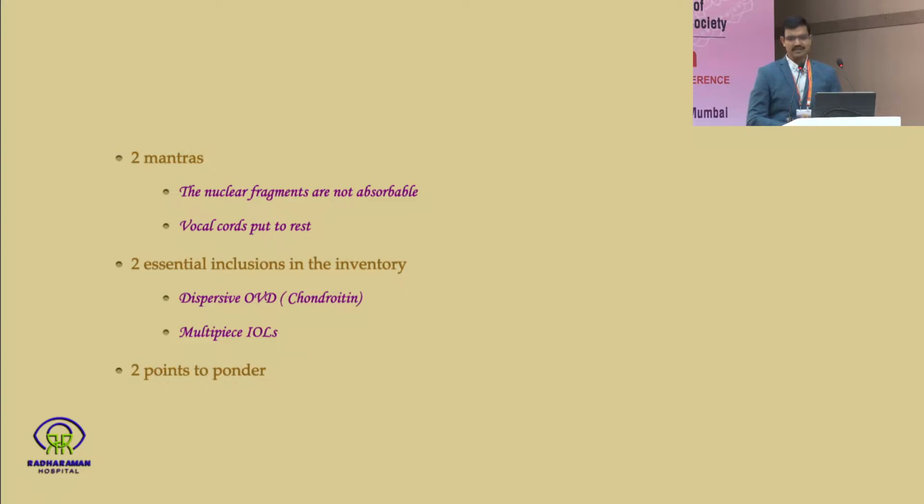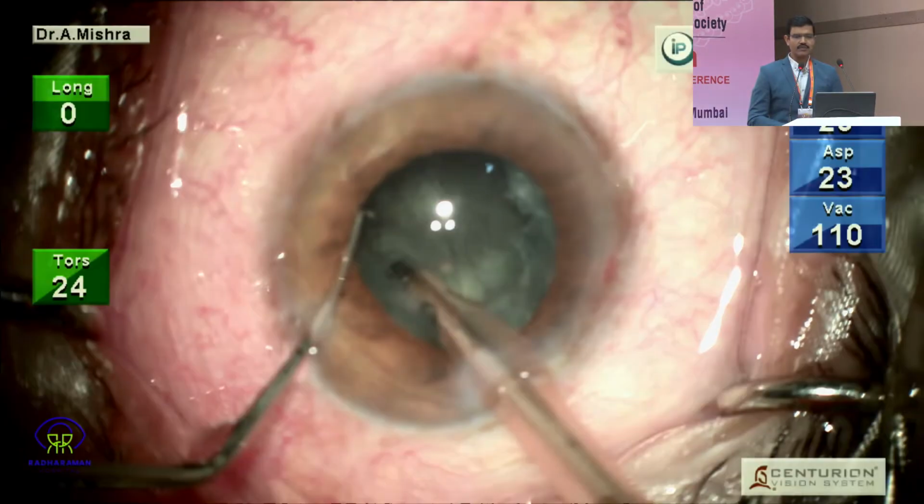One, essentially we have to recognize the PCR happening at the earliest stage possible, and to prevent its extension, of course. And then to continue with the nucleus fragmentation as we were doing up till that point in time. So these are the 2 points that we are going to expand on. How do we recognize it early?